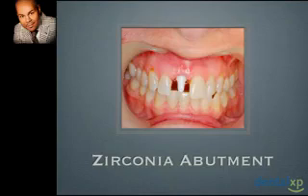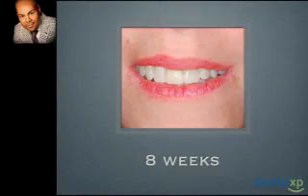And you can see mesiodistally we still have a good thick tissue fill. And in cases like this, one of the things that we want to be careful of is just how wide is our abutment design, because we do not want to squeeze out the blood supply to our papilla and to our bony interproximal bone in this area. If you bone sound this, as has been advocated by Dr. Salama and Garber, you'll see where we do have a nice level of bone interproximally, probably right at about 2 millimeters below this area. So just a straight-on view.